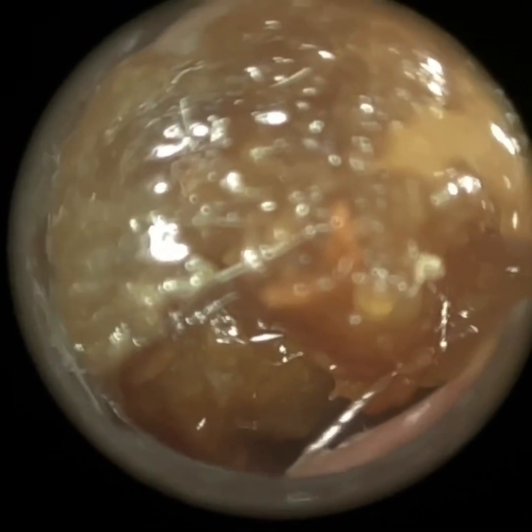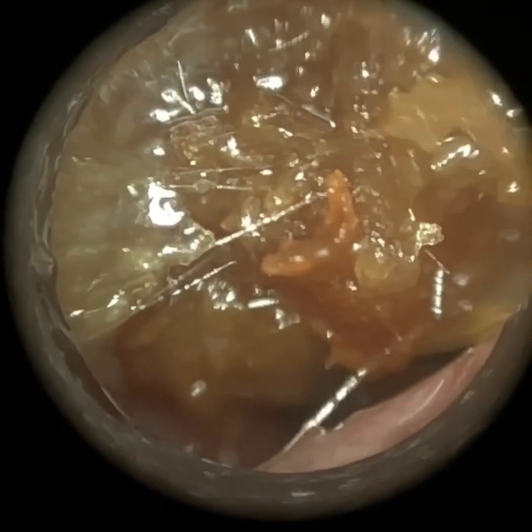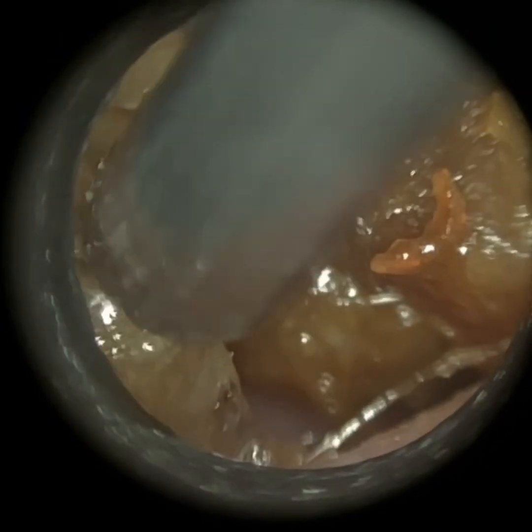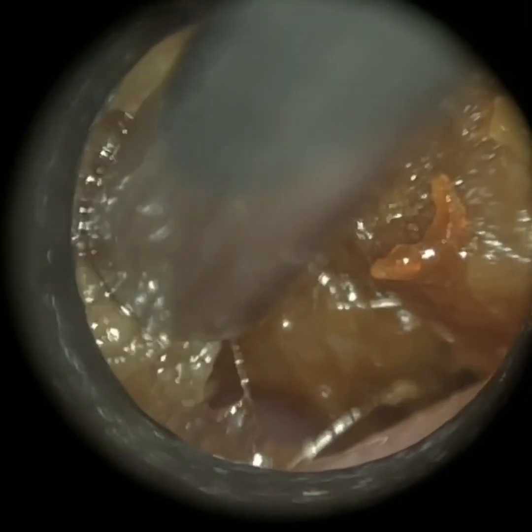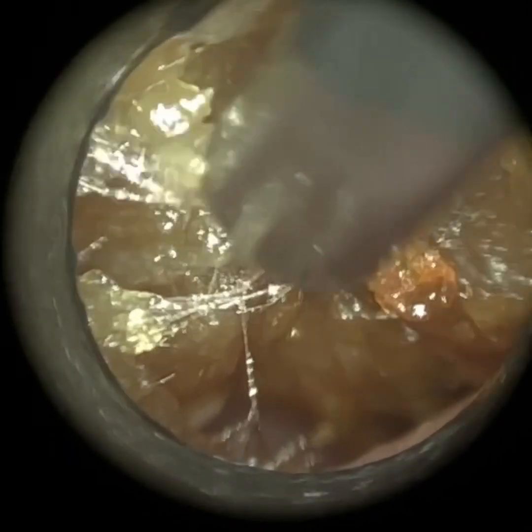As you can see, it just got blocked there. I've just removed the suction tube out of the ear, giving it a little shake — it's self-cleared. I'm now going to the back part of the ear canal. I want to reveal the posterior canal wall so I have a better idea of the anatomy and architecture of the ear canal.